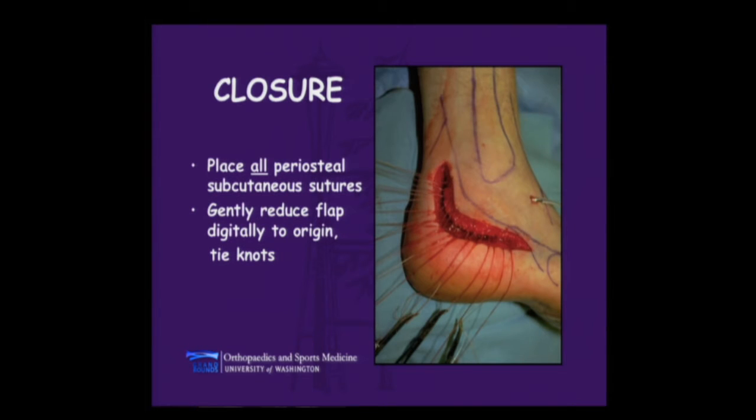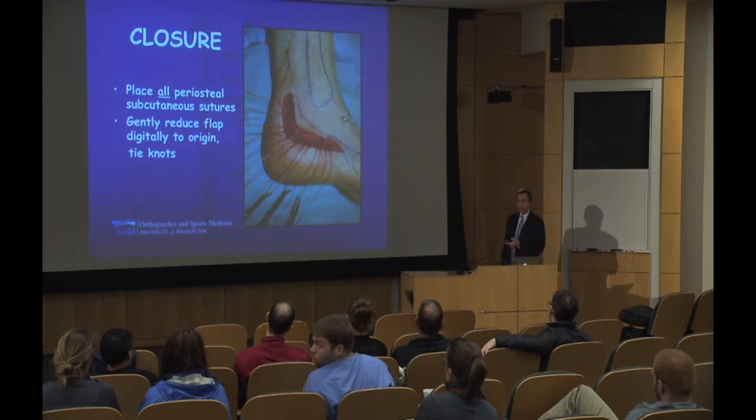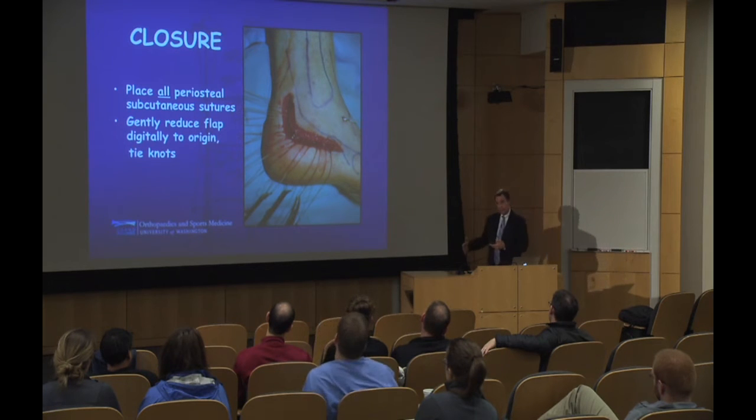When you close the wound, you have to do a periosteocutaneous flap. Once again, the old Bühler approach, which was here, had a very thin soft tissue envelope. Here you have a much more robust periosteocutaneous layer that you can use, and then all of these sutures are placed to essentially help you reestablish the flap position, which is now put on stretch because you've restored the shape of the heel. The closure of the skin should theoretically be with as little tension as possible because that's the one we're most concerned about, getting early sealing of the wound.